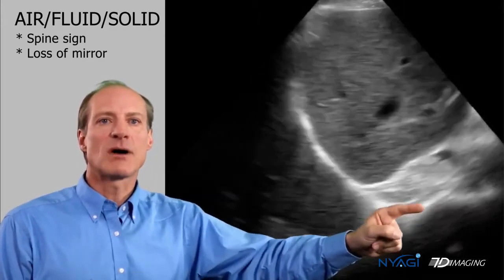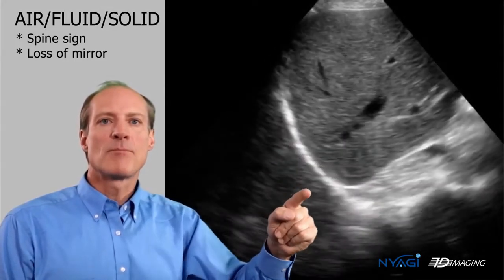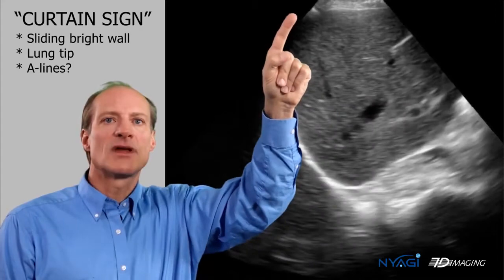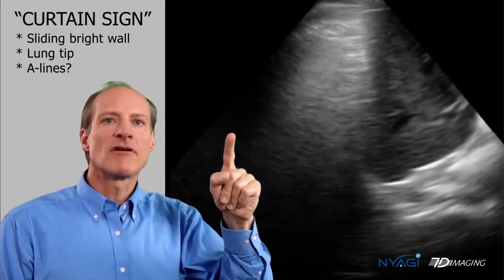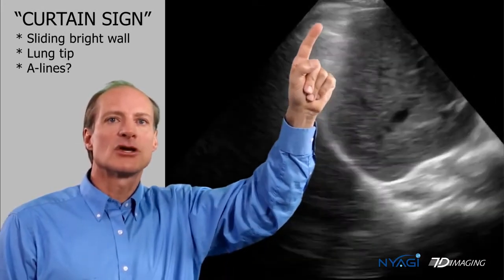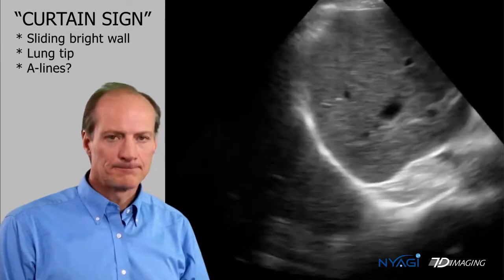If you see the spine reflection extending above the diaphragm, it means that there's something reflecting the sound waves above the diaphragm, which would either be fluid or solid. Also notice that you've got what's called a curtain sign in this video. You can see the aerated lung sliding across the probe face, blocking the sound waves from transmitting because, again, sound waves don't travel well in air. They travel well in fluid.